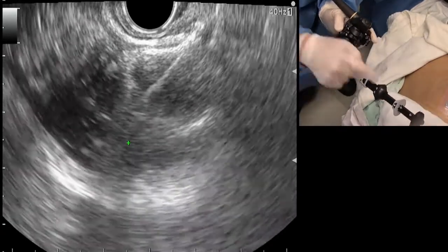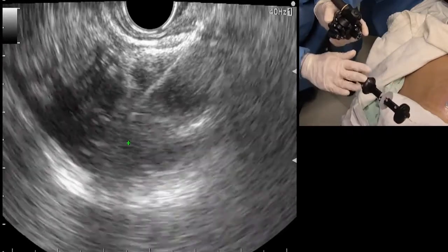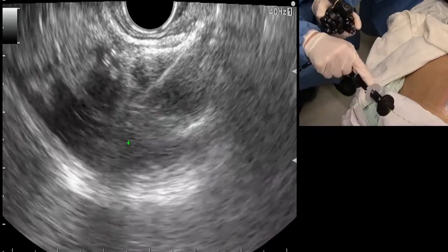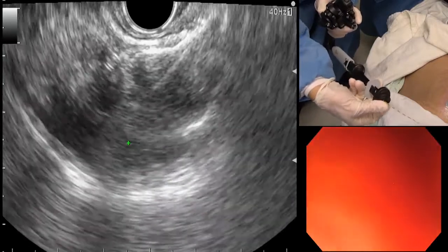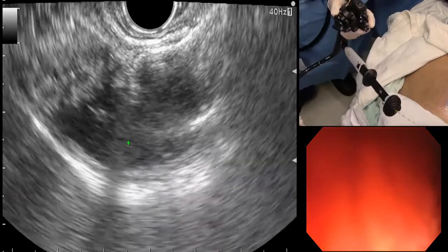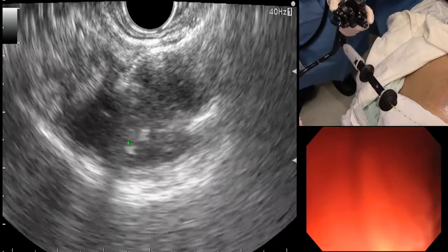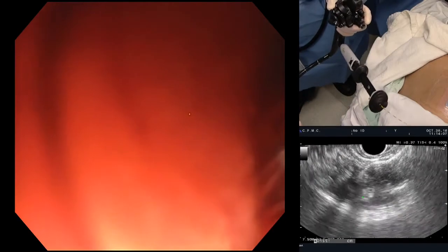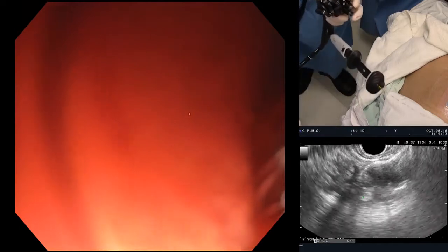All right, now, we're ready to deploy the proximal flange. I'm unlocking here. I've got my sheath locked, so nothing's going to happen with that. I've unlocked the gray hub again to deploy the proximal flange. Now, I'm just going to pull back, and of course that flange is going to deploy in the working channel. And it just deployed. Now, you can't see it deployed because it's in the working channel. So in order to see this, I have to switch to the endoscopic view. And what I'm going to do now is I'm going to push the proximal flange out of the working channel. So let's switch now to the endoscopic view.